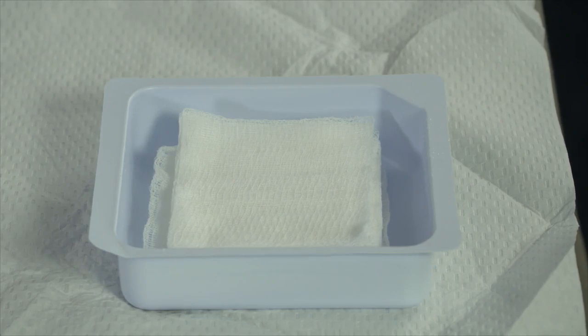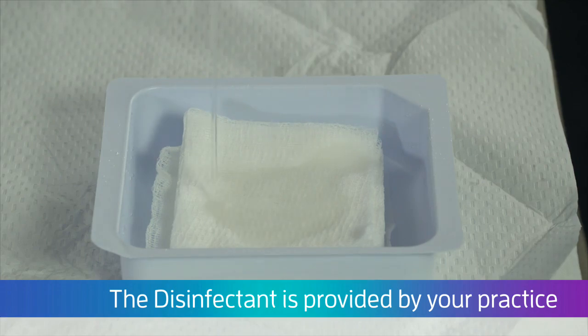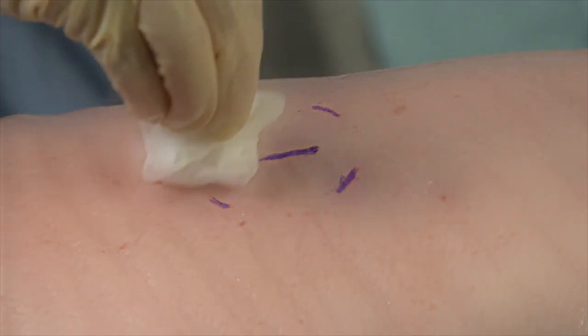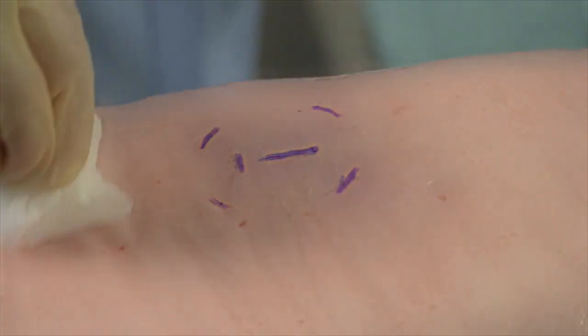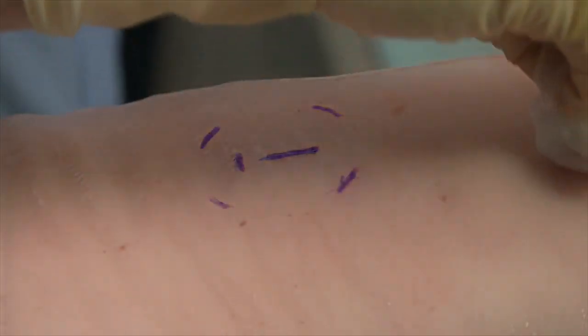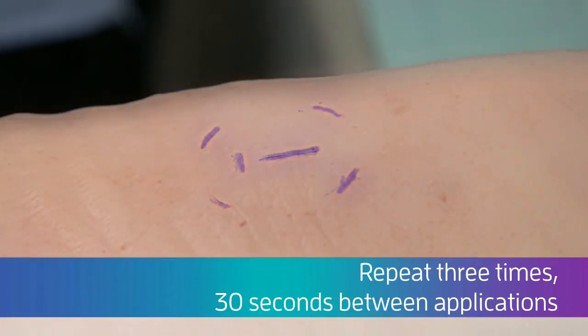Next, prepare the incision site. Using chlorhexidine or betadine, disinfect the site using sterile swabs or gauze. Apply at the planned incision line. Using a circular motion and moving outwardly, disinfect an area larger than the adhesive around the drape's aperture. Allow the disinfectant to dry for 30 seconds after each pass. Repeat for a total of 3 passes using a new swab or gauze each time.